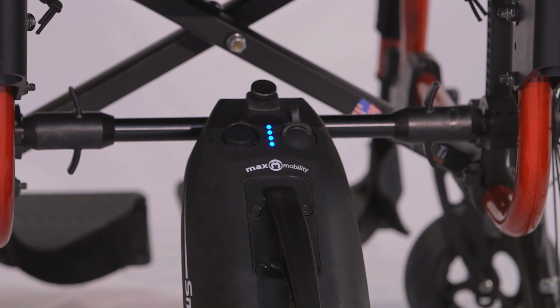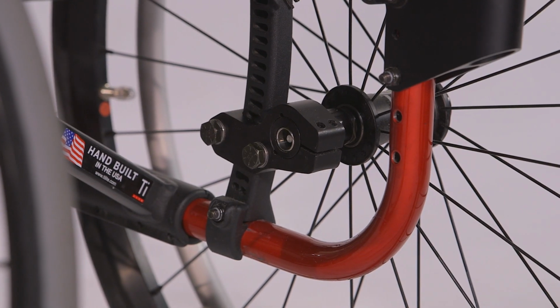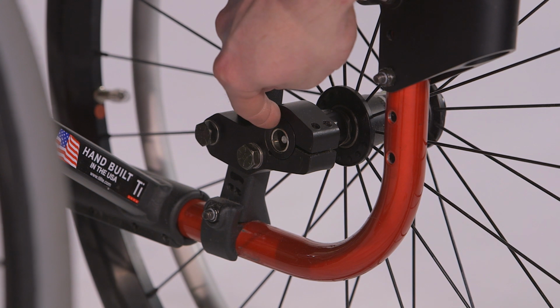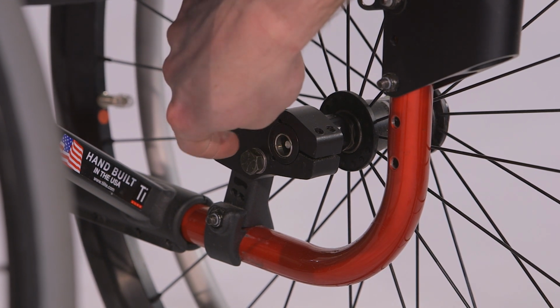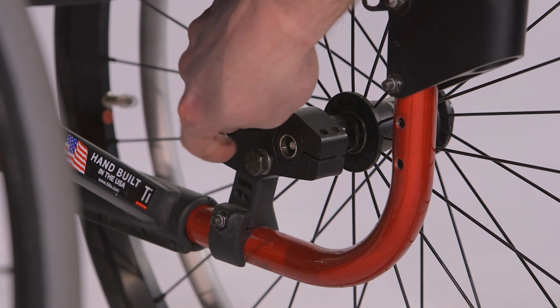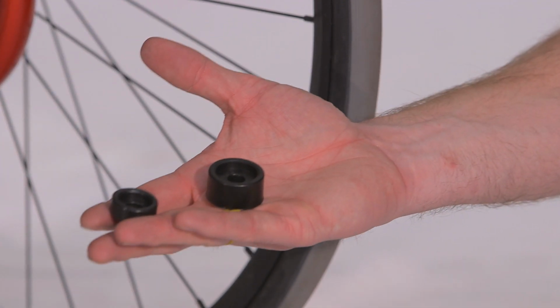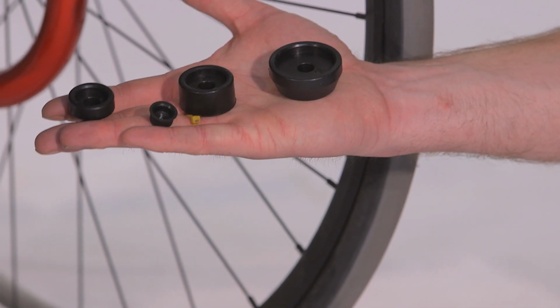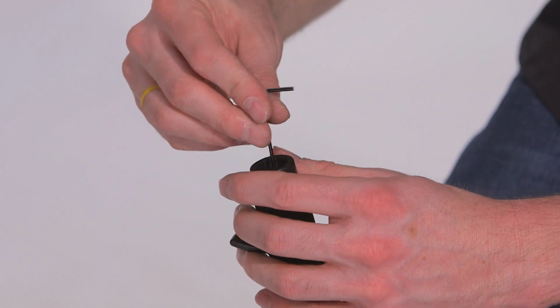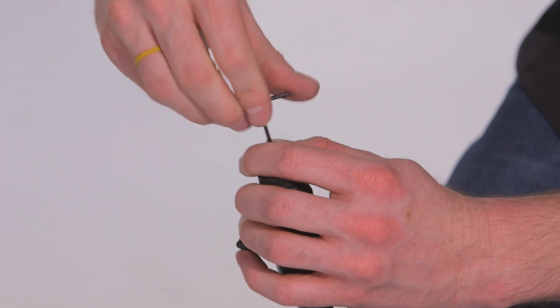Anytime adjustments are made to the wheelchair, be sure to adjust the adapter bar length if needed. Sometimes the axle tips are recessed or inaccessible, which is why we provide end cap inserts to engage other parts of the wheelchair, like bolt heads, nuts, and camber plugs. There are multiple inserts that can be used for different wheelchair models, so be sure to refer to the provided instructions for help. To attach the inserts, just use the provided hex wrench and screws to fasten the inserts to the end caps.